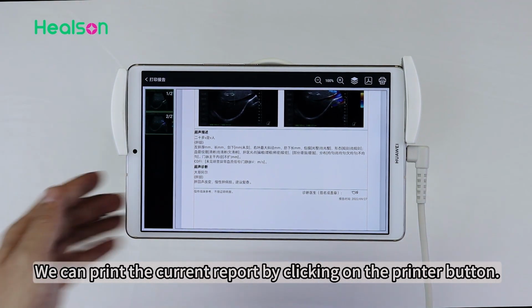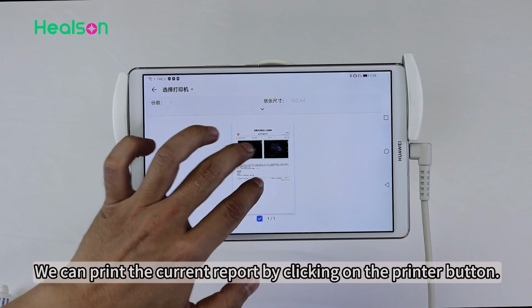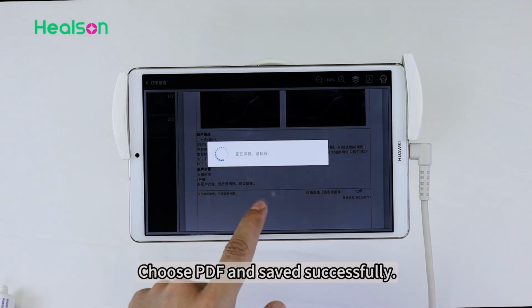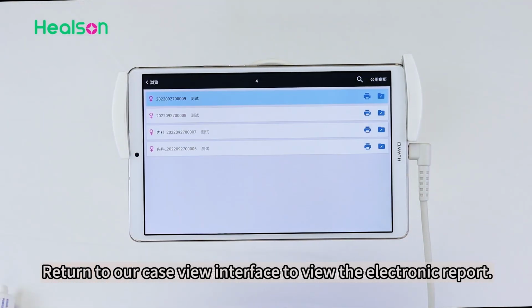We can print the current report by clicking on the Printer button. Also could save the electronic reports. Choose PDF and saved successfully. Return to our case view interface to view the electronic report.